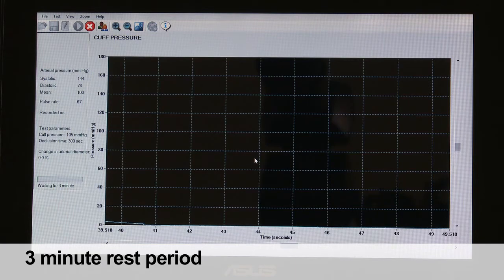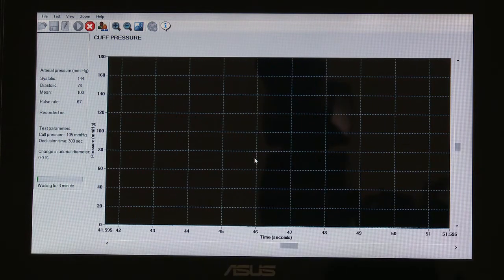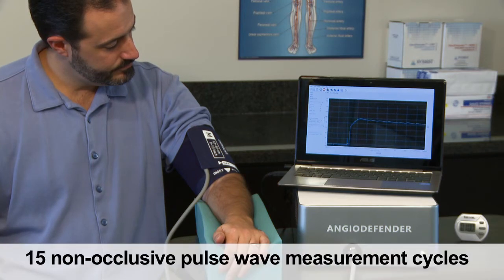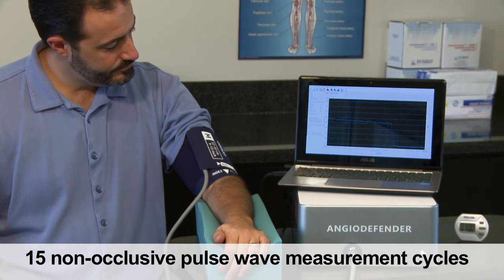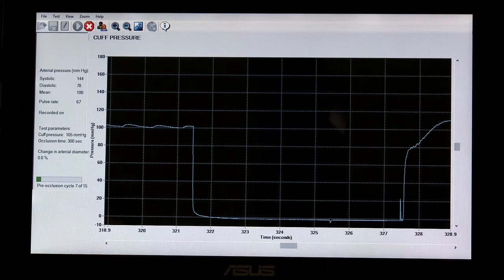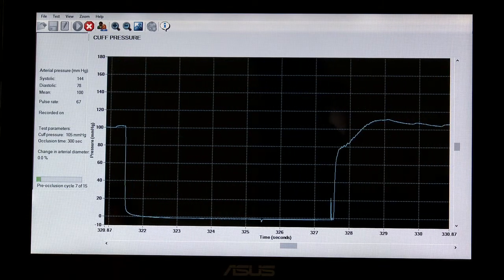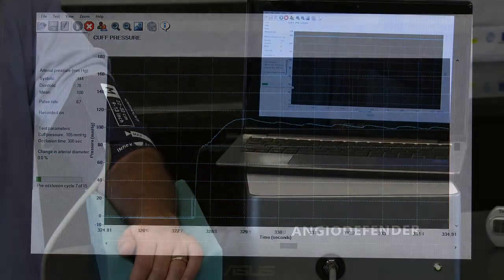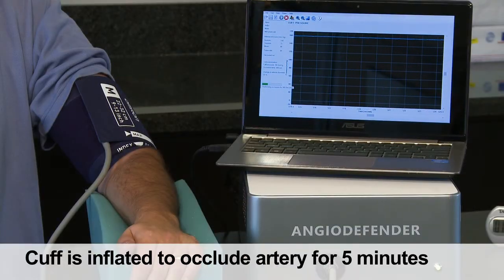The three-minute rest period allows the patient's arm to return to its rested state. After that, there is a sequence of 15 non-occlusive pulse wave measurement cycles, each consisting of nine seconds with the cuff inflated to approximately mean arterial pressure, followed by six seconds with the cuff deflated.